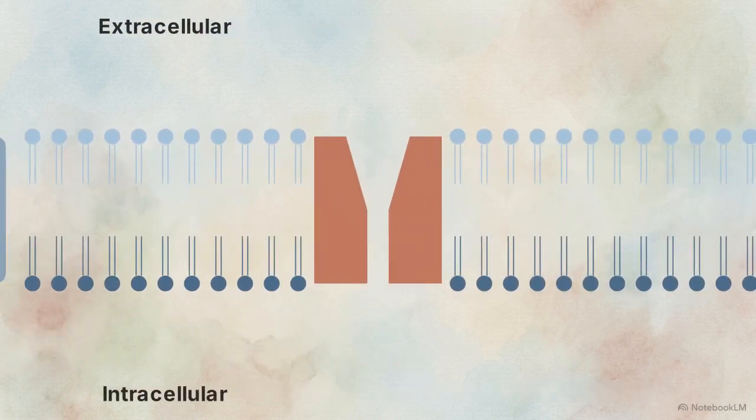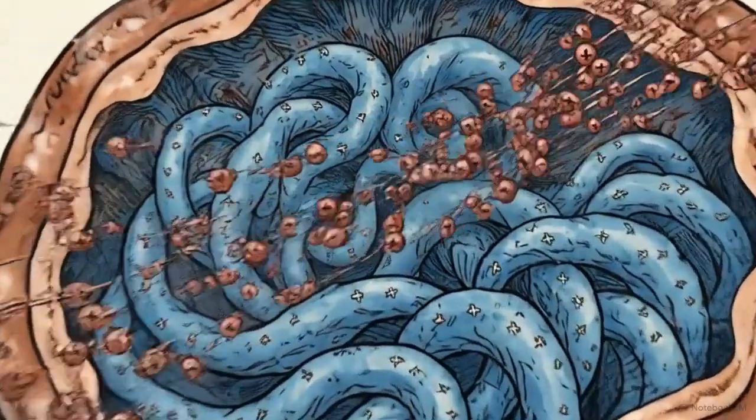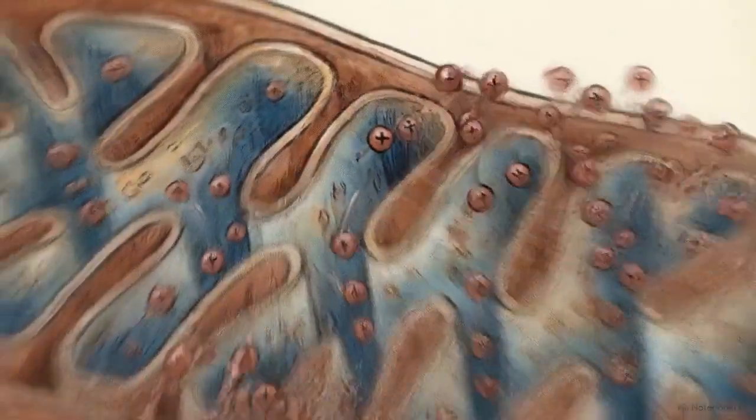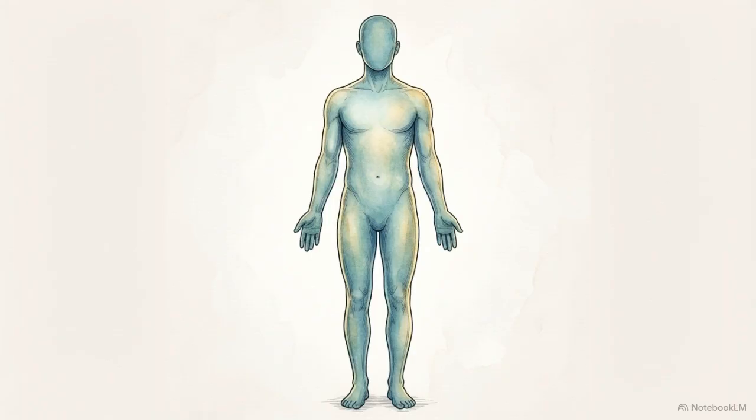It depends entirely on the sodium-potassium ATP pump for active transport. Technetium-sestamibi operates as a lipophilic cation. It passively diffuses into the cell and latches directly onto negatively charged mitochondrial membranes. These distinct diagnostic scans are macroscopic portraits of basic basal metabolic pumps. We return to the featureless scan from the beginning of the evaluation.